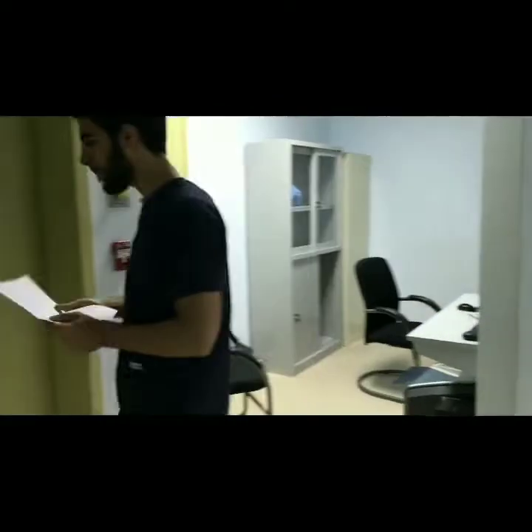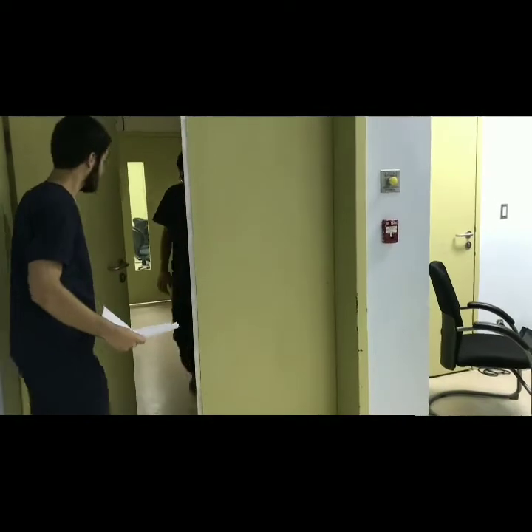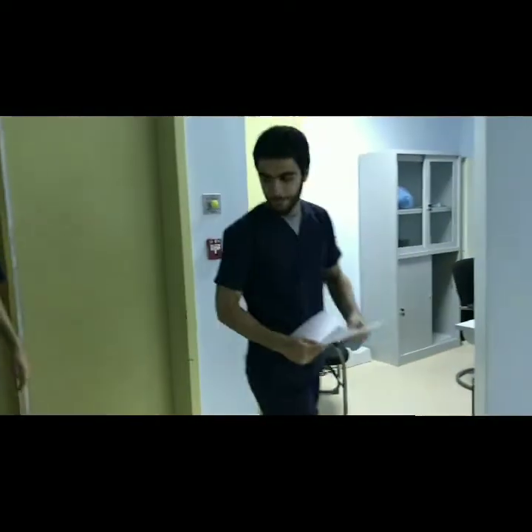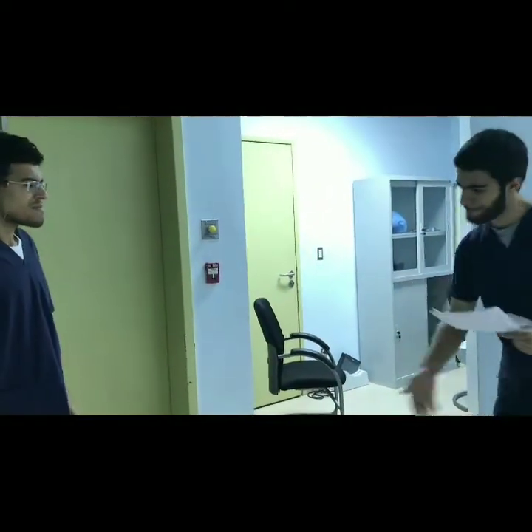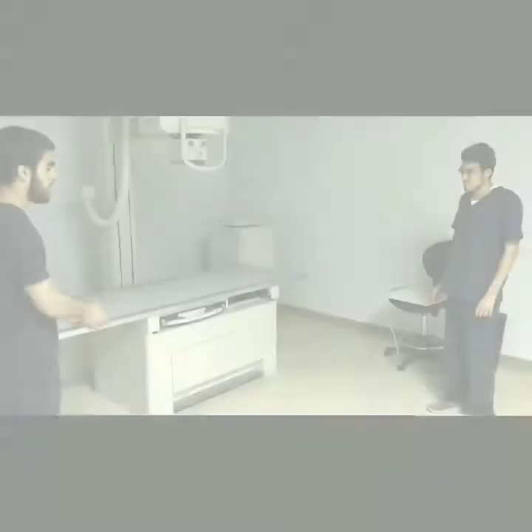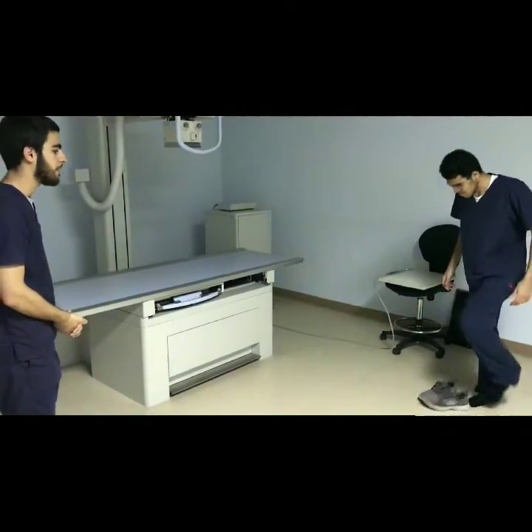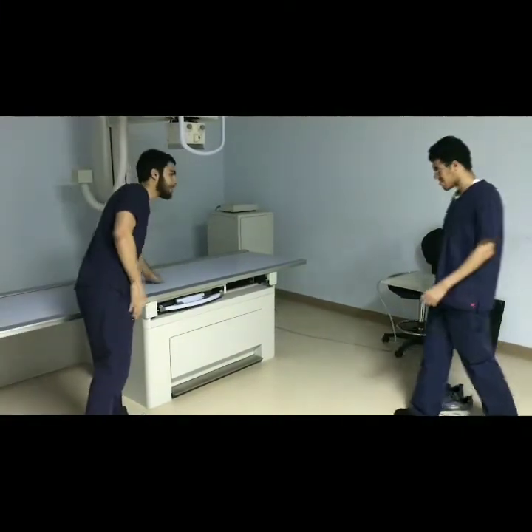Take your notes and patient history, then greet the patient with passion. At this stage you also need to confirm your data or notes related to the patient. Ask the patient to take off his shoes and sit in the middle of the table to attain flexibility for further adjustments.